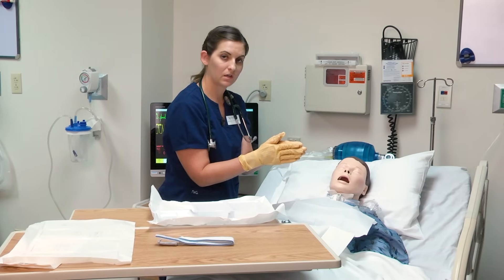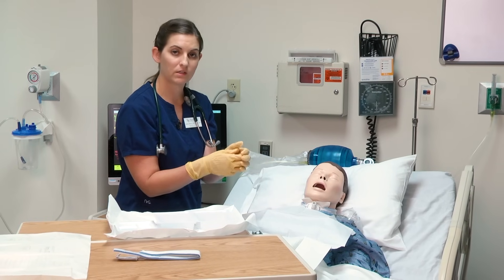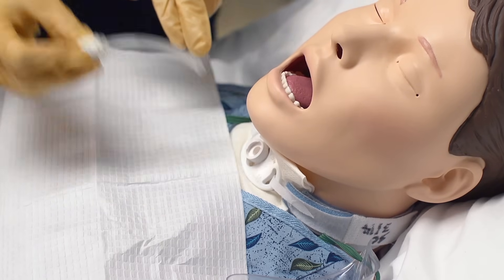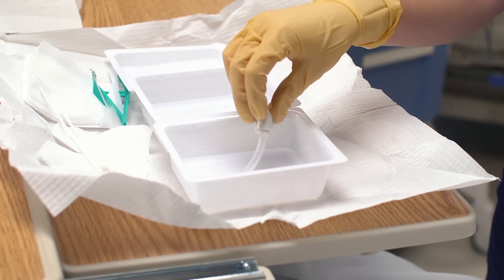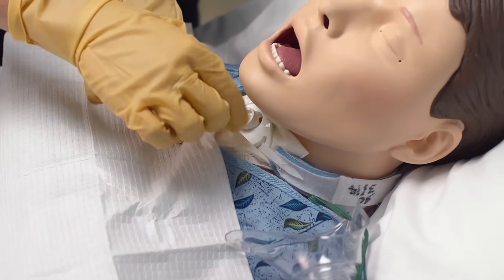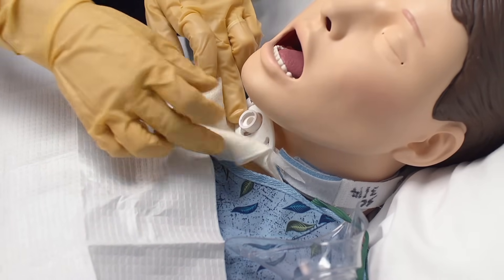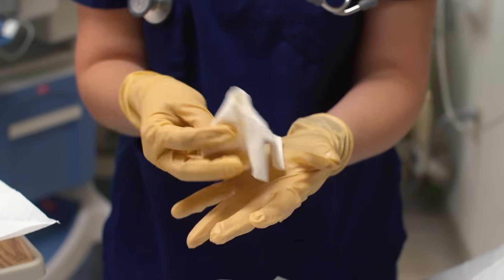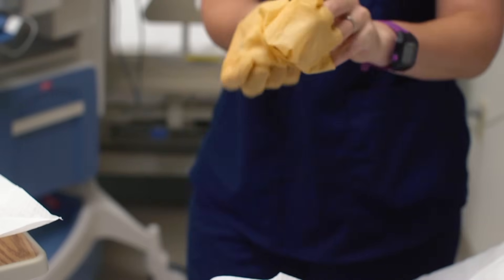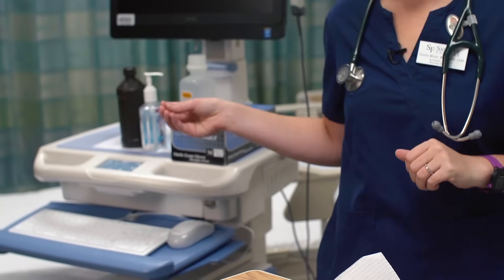What I need to do now is remove the inner cannula of the tracheostomy, then remove the old dressing around the tracheostomy. You want to twist and remove. I'm going to place the inner cannula inside the hydrogen peroxide, then remove the old dressing from underneath the trach faceplate, looking for any drainage. I'll wrap the old dressing in my gloves, discard my gloves, and hand sanitize without turning my back on my sterile field and patient.